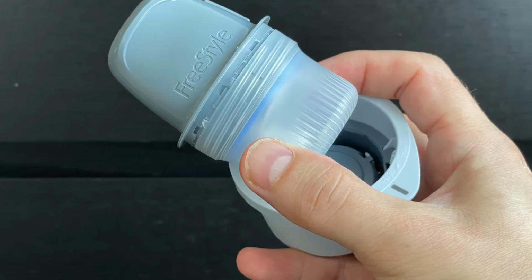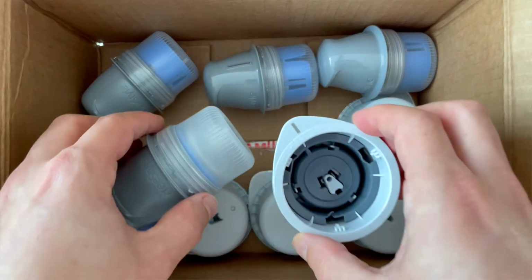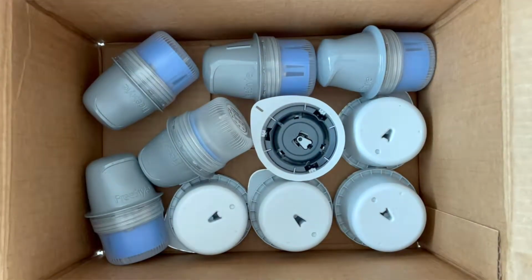Do you know how much plastic waste comes out of the FreeStyle Libre applicators? I calculated it. If you use FreeStyle Libre sensors regularly, then you need at least 26 sensors per year. I keep my Libre waste in this box. Now when I start putting the used kits one next to another, they will cover the bottom of this box in 10 weeks. In half a year, this box will be full. So every year I fill 2 of these boxes just with my Libre waste.